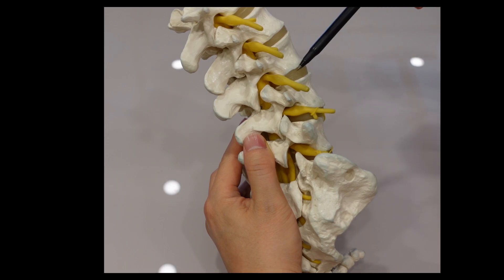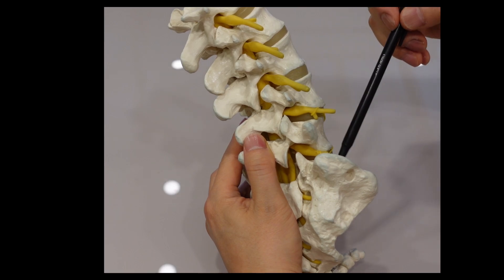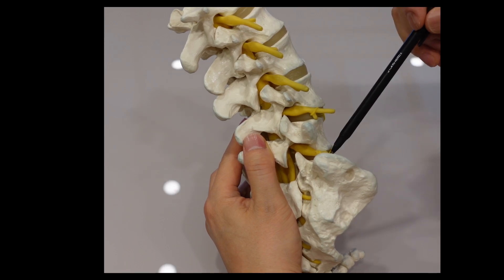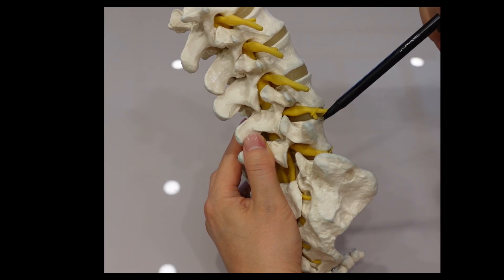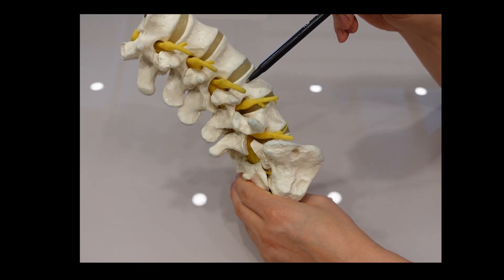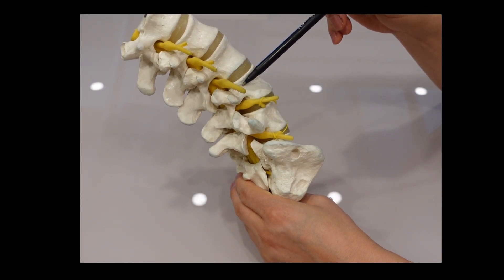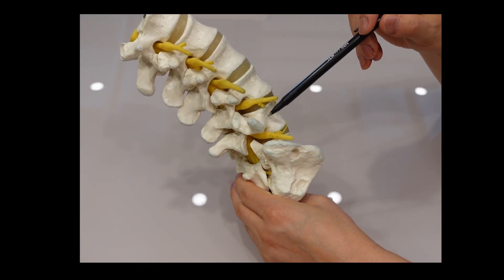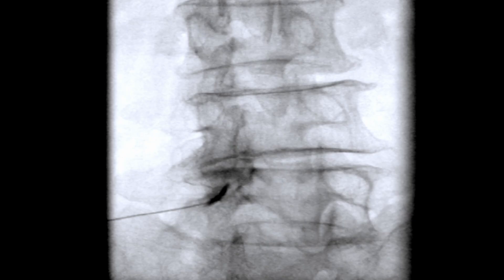Third, in cases where root irritation occurs outside of the intervertebral foramen, the infranural injection is the most effective treatment to relieve the pain caused by a lateral disc protrusion.